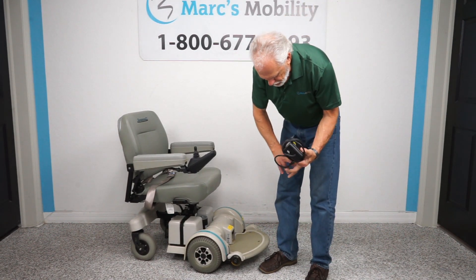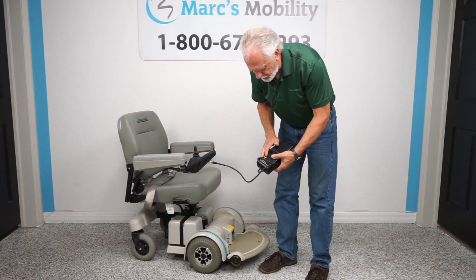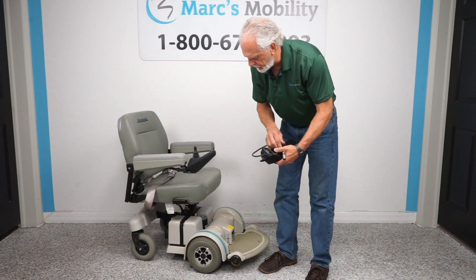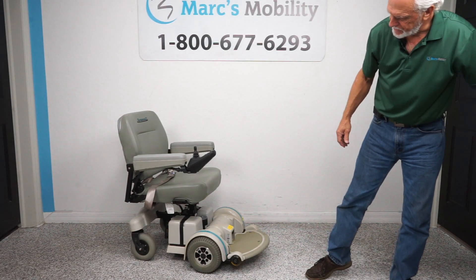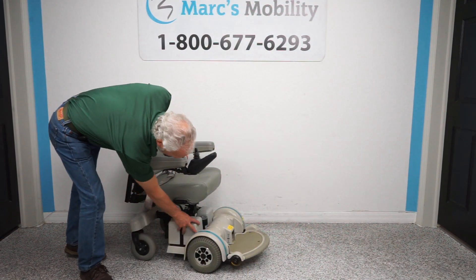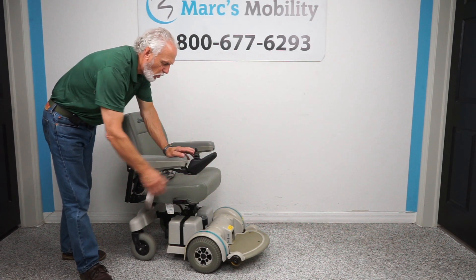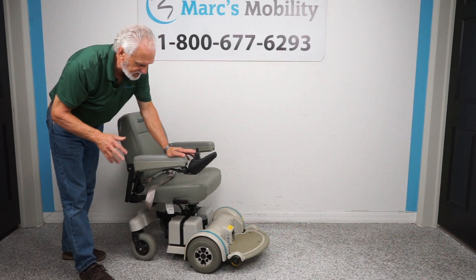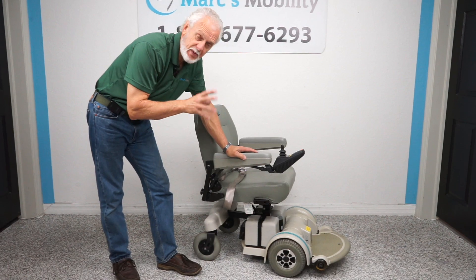When you charge the batteries, you'll get a charger with the chair. The charger plugs in right here below the seat, and as soon as the light turns green, the charger will stop — these are smart chargers that know when to stop charging. You have two batteries, one on each side, and it takes both to run this chair.